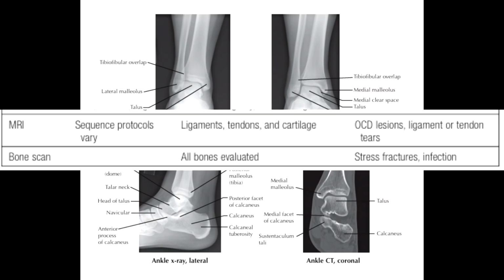And finally, bone scans can be employed when stress fractures or subtle pathologies are suspected but are not visible on plain radiographs. These scans detect areas of increased metabolic activity in bone, highlighting stress injuries, infections, or early fractures before they become apparent on X-ray.